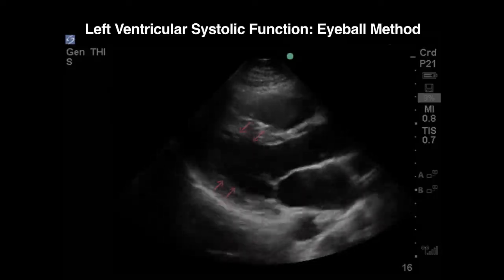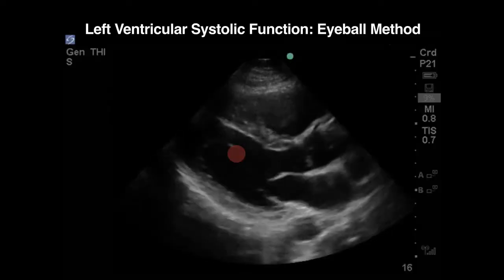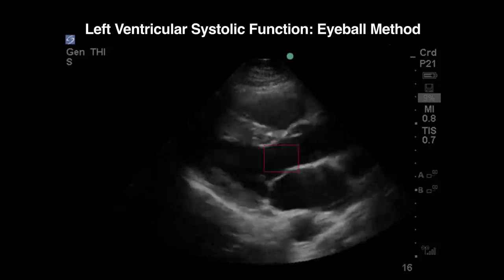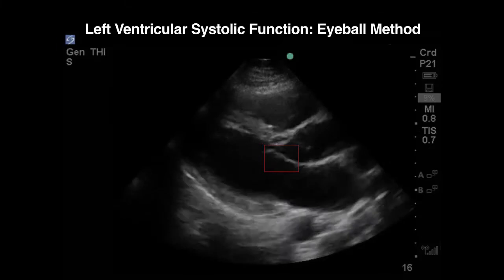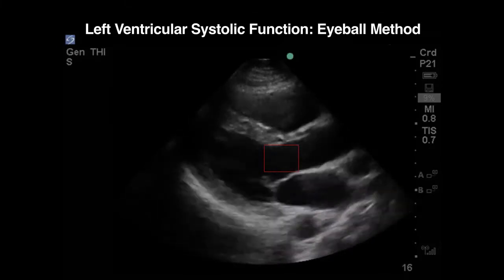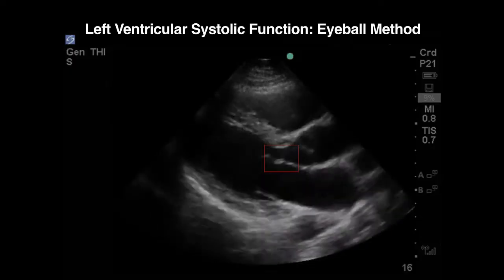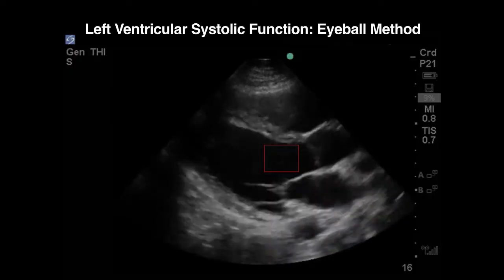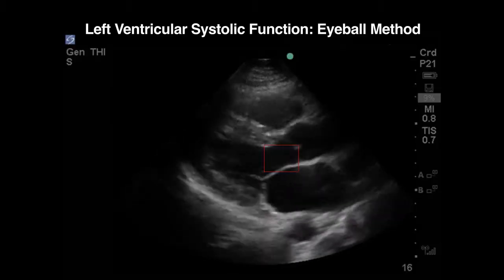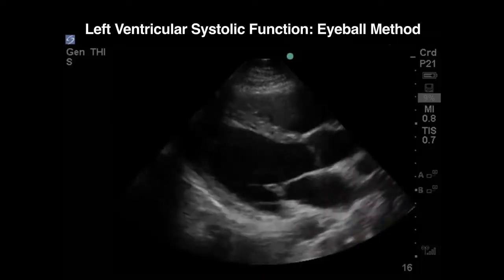So you should be assessing for myocardial thickening, endocardial excursion, making sure that endocardium moves towards a centric point in the LV cavity, and of course, when it's visible, does the mitral valve open freely, something called EPSS in the classic echo literature. Ultimately, the mitral valve leaflet on the anterior side should approximate the septum if the LV function is good. These 3 easy visual cues will allow you to interpret left ventricular function with a great deal of accuracy and sort through your patients as to who has LV failure and who does not most of the time, as we will discuss shortly.